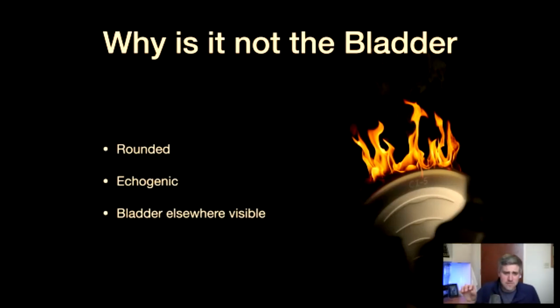If you look for the pubic symphysis, go immediately above it, you can see the decompressed bladder that's separate from the structure that we're assuming is the bladder, indicating that we're off to the wrong start to begin with, right? So that's case two. Here's case three, right?